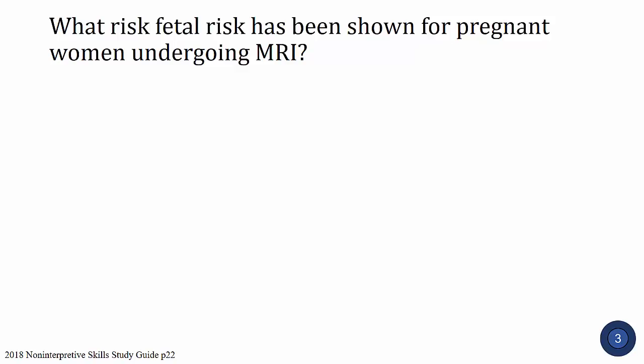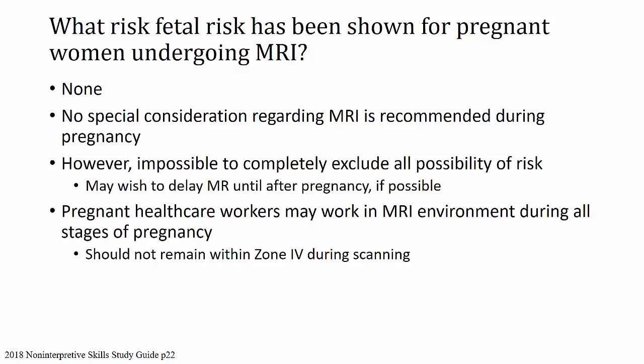Next question. What fetal risk has been shown for pregnant women undergoing MRI? So here again, we're talking about undergoing the MRI. We're not talking about contrast, for example. And the answer is none has been definitively shown. No risk has been definitively shown for pregnant patients undergoing MRI, either to the patient or to the fetus.